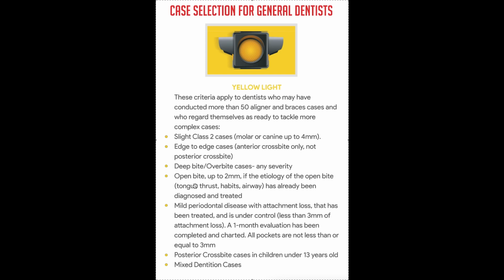No problem. So you need to know what caused it, and that cause has to be fixed before you get started, like the OMT says it's okay for you to take this case. Remember, OMT is going to add a couple thousand dollars onto the case unless you're offering OMT services in your practice, which you can. It's not hard. You can get your hygienist trained in less than a month, sometimes even less than a week if they really go for it. And you can start billing for that.